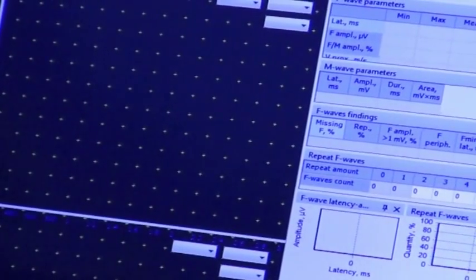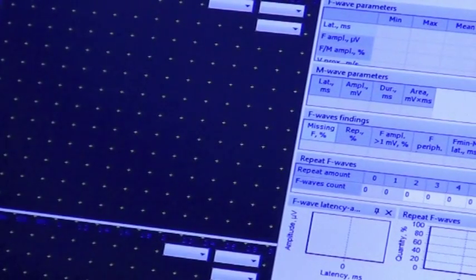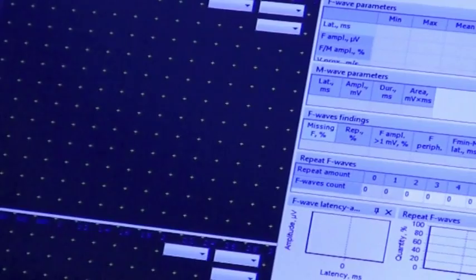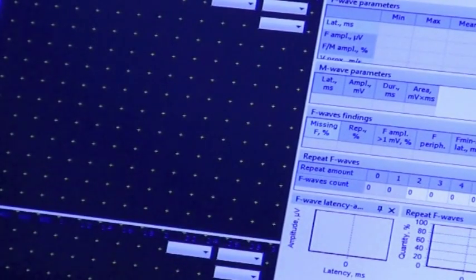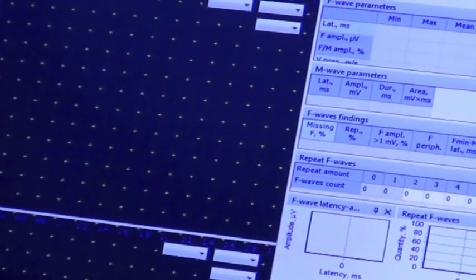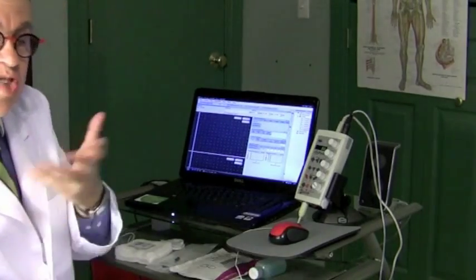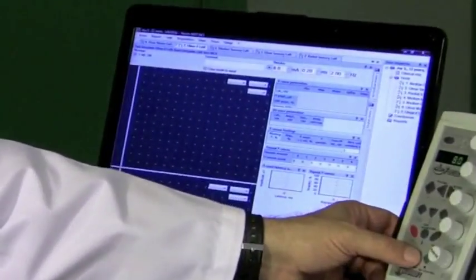And for the F wave, like I said before, we always stimulate at the wrist. Okay, I'm going to try to get my hand out of the way here. Here we go. So I'm going to use some electricity, and again, I want you to squeeze the ball. You can ask them how much money they owe on their credit card. That always does it as well. Just distract them. So here we go.